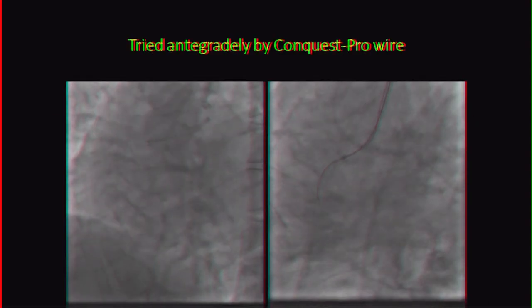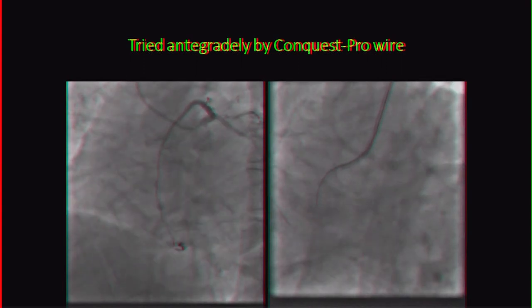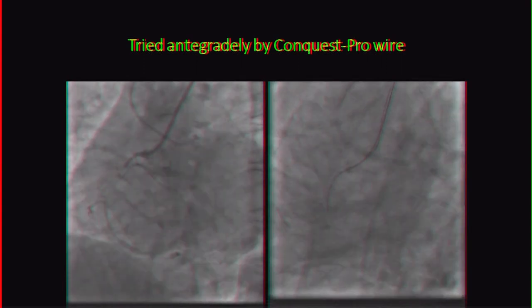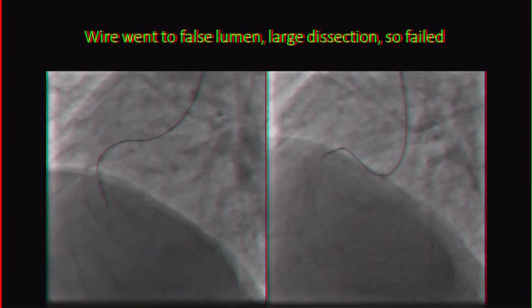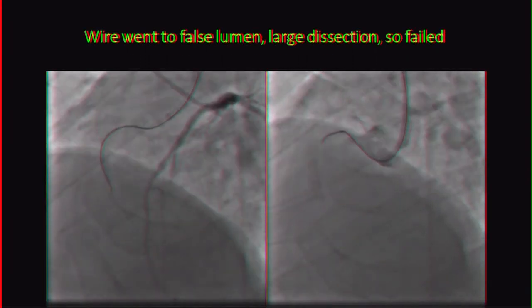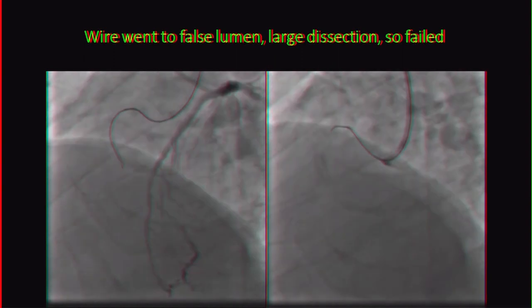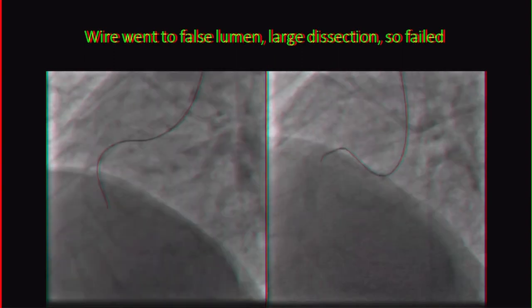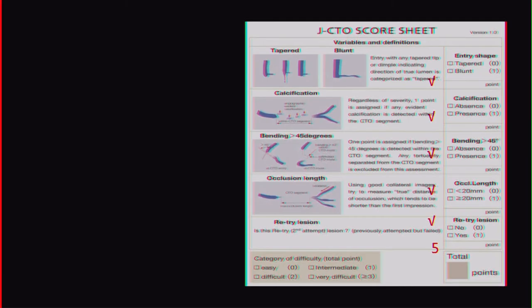They used a Conquest Pro wire, but unfortunately it went into the false lumen and there was a big dissection, so the case failed and was postponed.